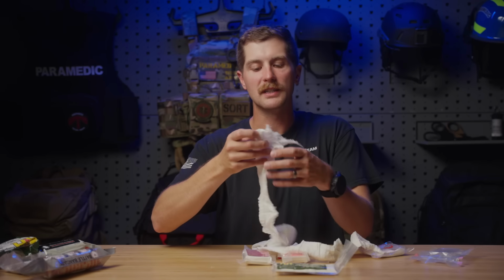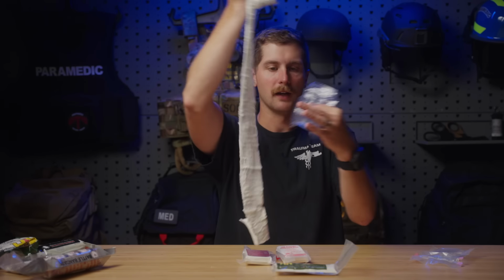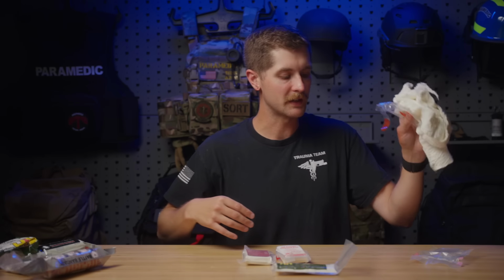Now, this is a very similar consistency to the other gauze, but I'd say it's a little bit more fibrous. They're even a little bit more messy. So you've got a fair amount of it in there that comes in that packaging. So don't get confused by secondary packaging. There are a lot of different brands that do that for various different reasons.